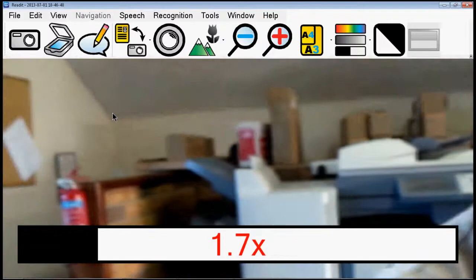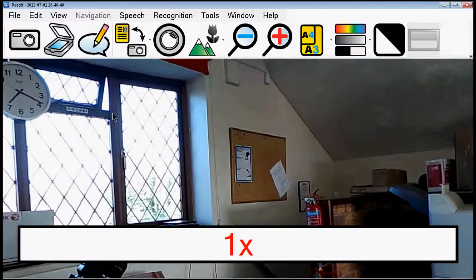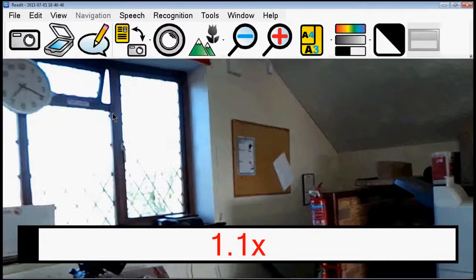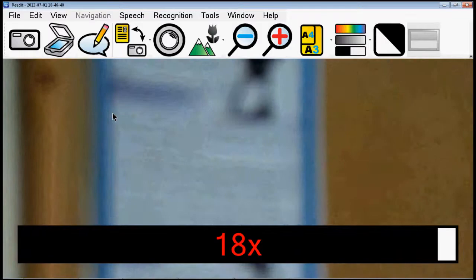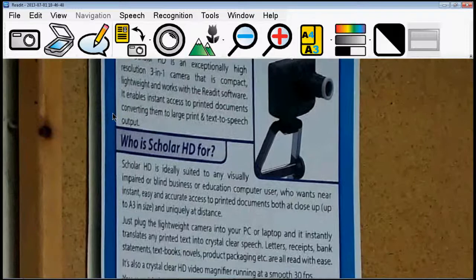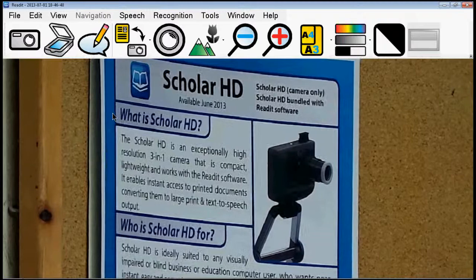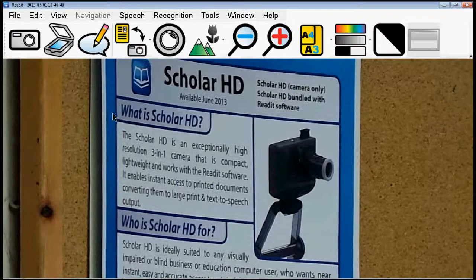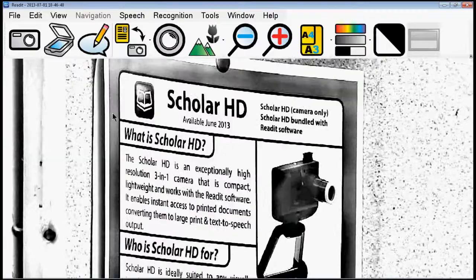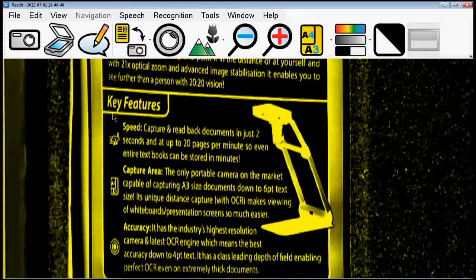It automatically detects when I lift the camera up that it's gone into distance mode and remembers a set zoom level for that. Excuse the mess in the office. Over there I have a notice board which, if I zoom all the way out, is actually far too small for me to read myself at this distance. But with the Scholar HD camera we can zoom in — that's maximum zoom, nice and clear. This is me holding the camera up and yet the image is still stable. People banging on the desk makes very little difference to the image quality, unlike other distance video magnifiers which are really badly affected by vibrations.